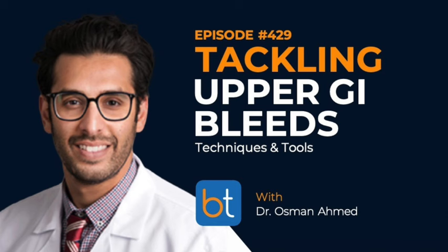I think that's the appeal of the pushable coil, that you can kind of shoot them in, and the trainees love that. But again, it's got to be in the right scenario, in a really safe situation, that sort of thing.